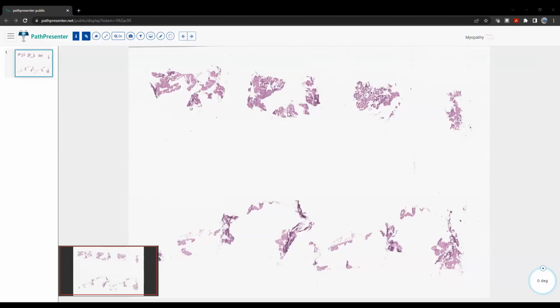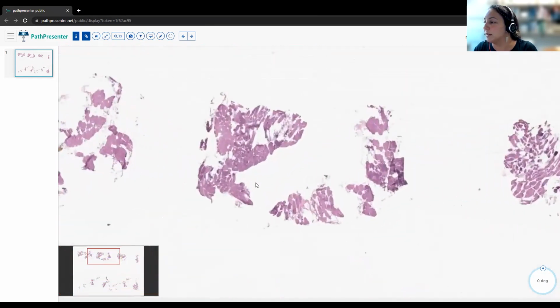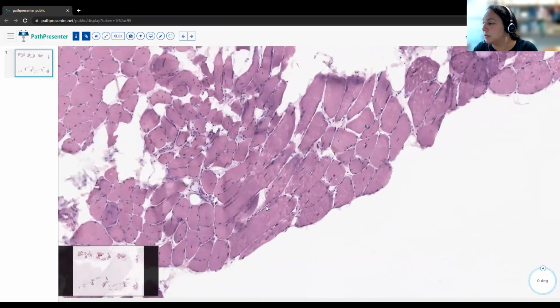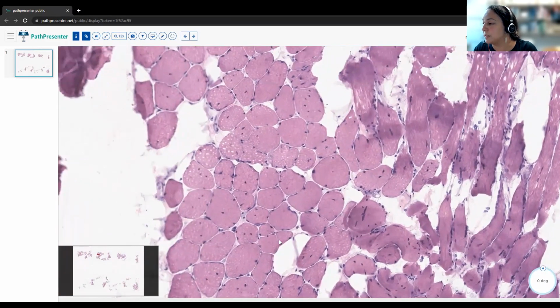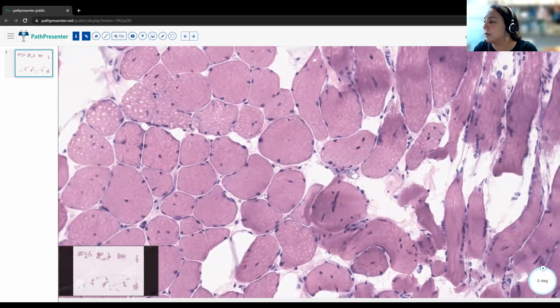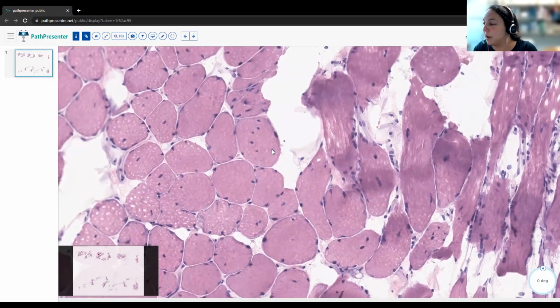Thank you. Okay, and so this was not easy to cut, this muscle biopsy. It definitely had some problems because there was a lot of fatty infiltration. So one of the first things that you will notice if you come over here to where it's better oriented, this was also clearly difficult to orient, is that there is some fiber size variation. You have some fibers that are smaller, some that are very small, and some that are much larger. And then we have increased internalized nuclei, right? So these are significantly increased internalized nuclei, a little bit of splitting as another non-specific myopathic change.